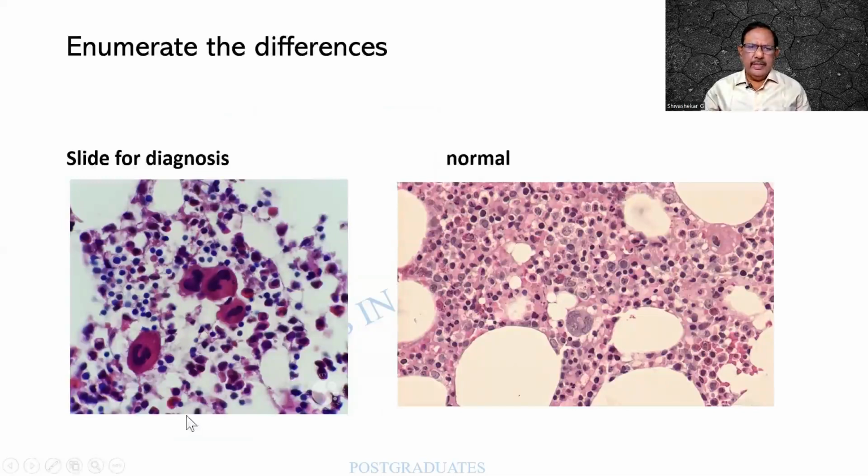Again, I find a normo or mild hypocellularity over here. These cells are probably the erythroid precursors, but there are too many of them similar and together. And there are some larger cells also. These larger cells attract my attention. They are huge, having a dumbbell-shaped nucleus with an involution, or sometimes they are just ovoid in appearance.